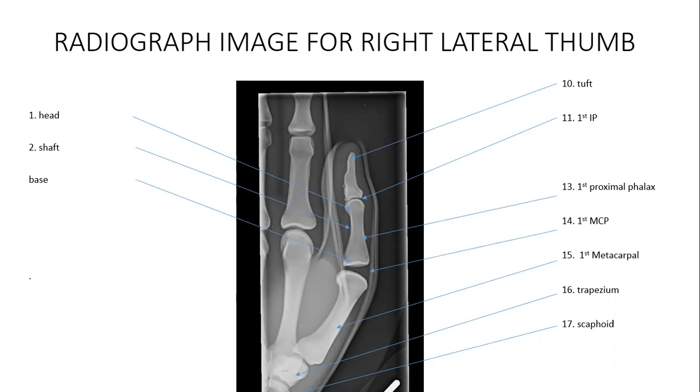and the trapezium. The pathology and clinical indicators for the lateral thumb include fractures and dislocations of the distal and proximal phalanx, the distal metacarpal and its associated joints. Pathologic processes such as osteoporosis and osteoarthritis of the distal and proximal phalanxes. The sesamoid, as well as the trapezium and the joints associated with the thumb, should all be in plain view.